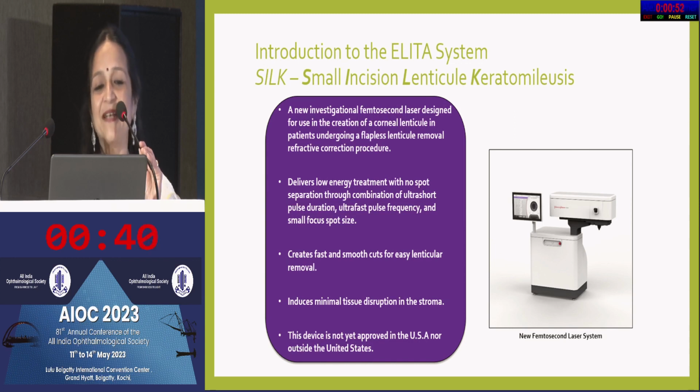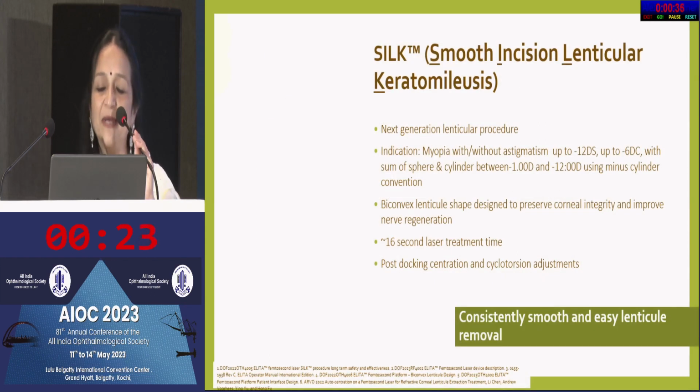SILK stands for small incision lenticule keratomileusis, done by the J&J laser. I'll just take half a minute more. It's a new investigational femtosecond laser design. It's not yet available. It's not FDA approved and also not outside USA. It's still getting investigated, but it's again a next generation lenticular procedure.